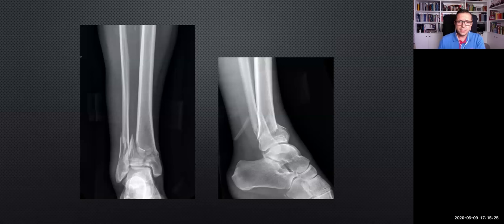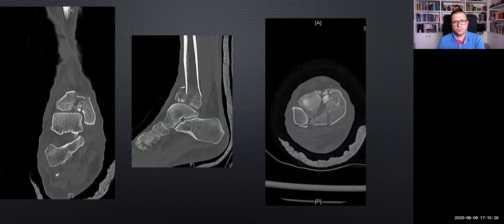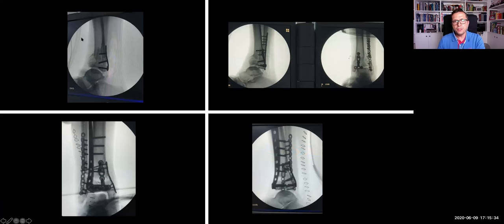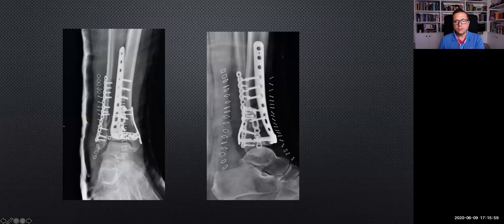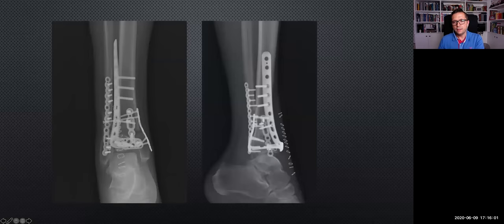Another comminuted case, type III again — you see the central defect and very comminuted fragments, but even in this case we follow the same principles. First, using the MedArtist plate — first the posterior fragment. In this case, up to four plates: anterolateral for the tibia, posterior T plate for the posterior fragment, medial plate, and a reconstruction plate for the fibula, with a good result. You can see at three weeks post-op a good restoration of the joint line.